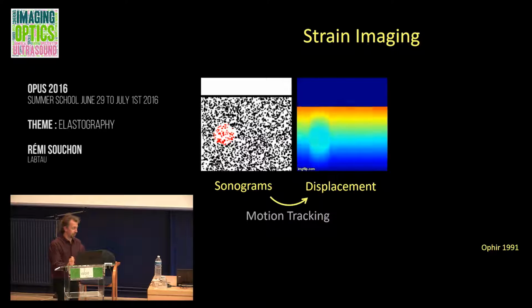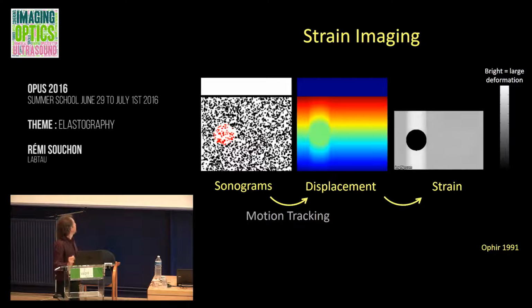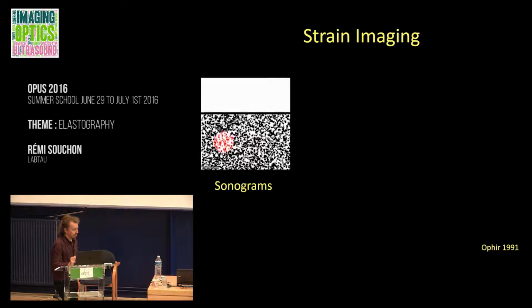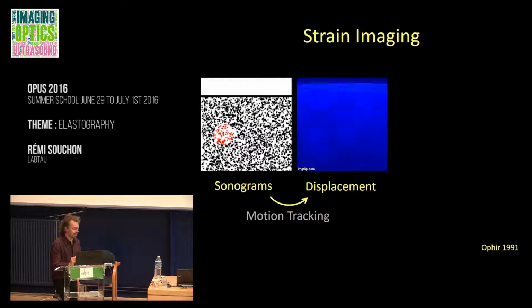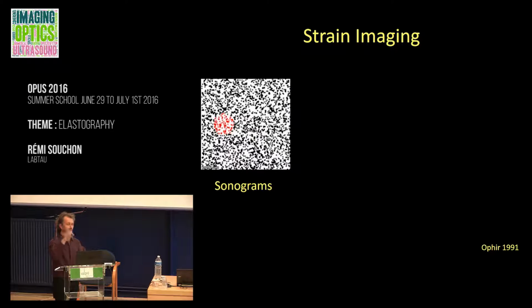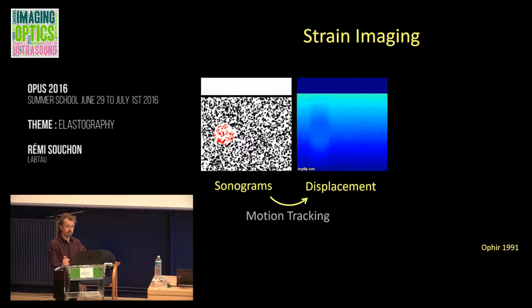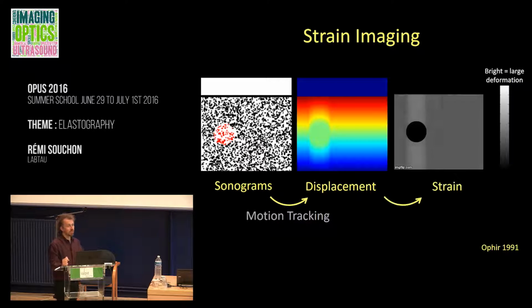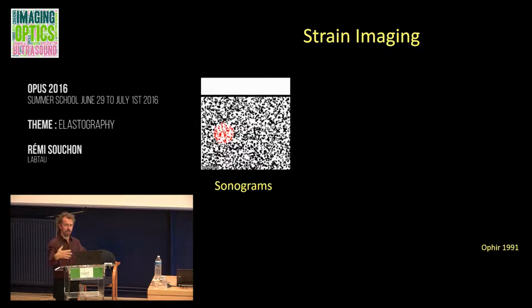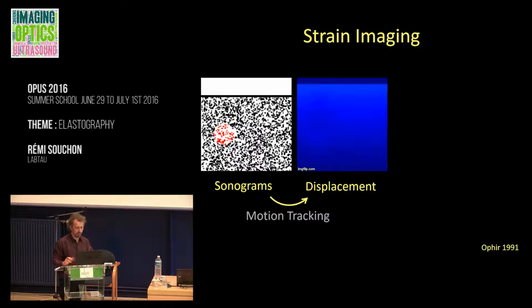So just to show you how it's going here, for those of you who didn't see it, there was some hard inclusion in this previous example, and here it's represented in red to help you see it. So I keep squeezing here, and if I imagine tracking all of these particles and create a displacement map showing the value of the displacement for each particle, because displacement changes in time, I will end up with a displacement moving. That will actually look like this.